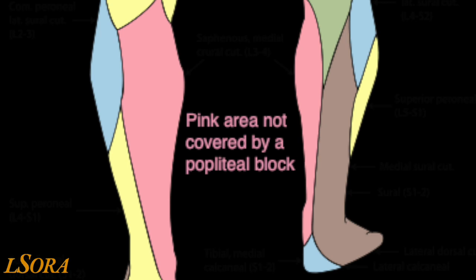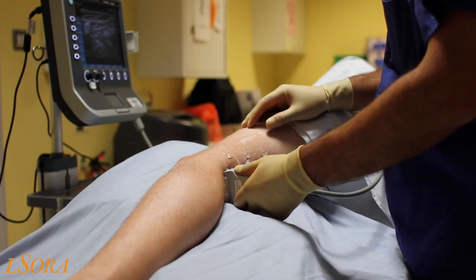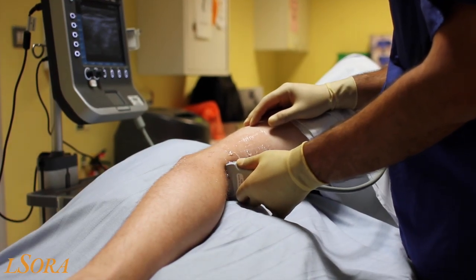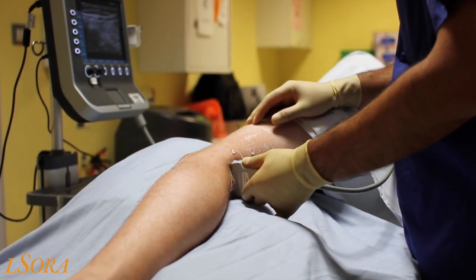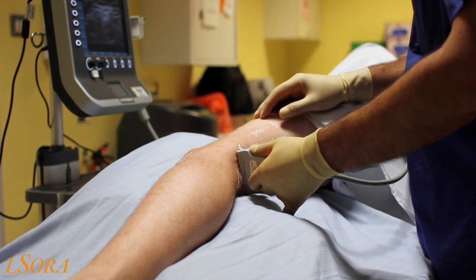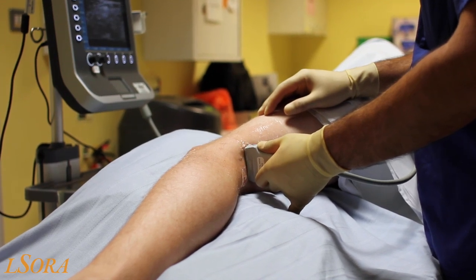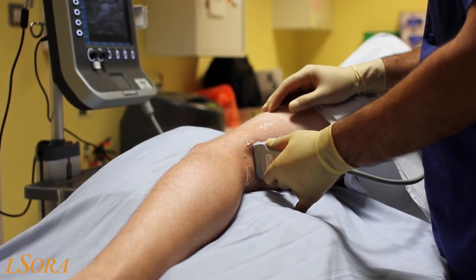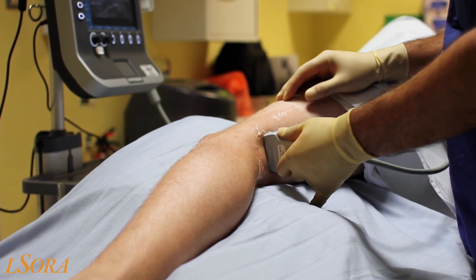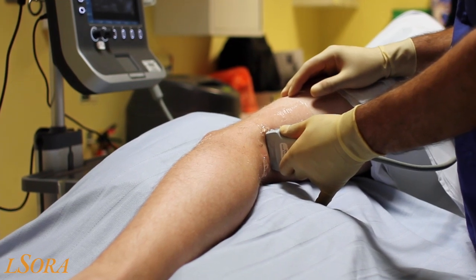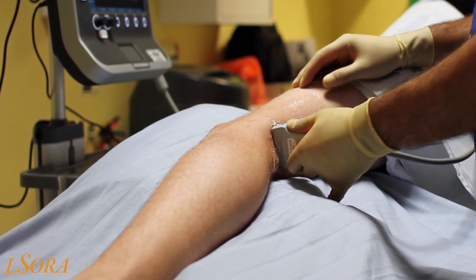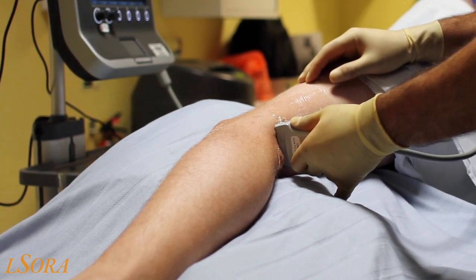In order to scan for the popliteal sciatic nerve block, the patient can be supine, prone, or lateral. You can see here the patient is positioned in the lateral position with a pillow between their knees for patient comfort.